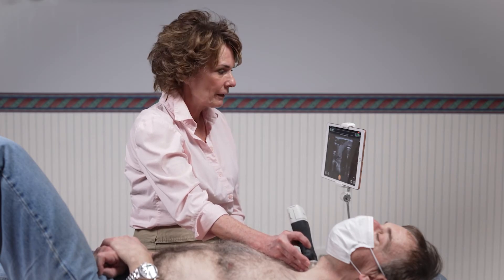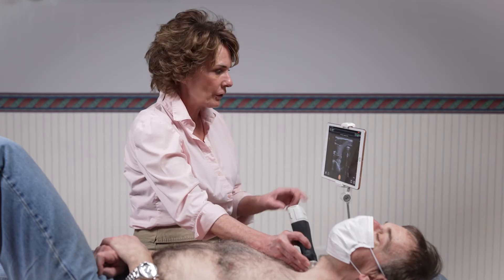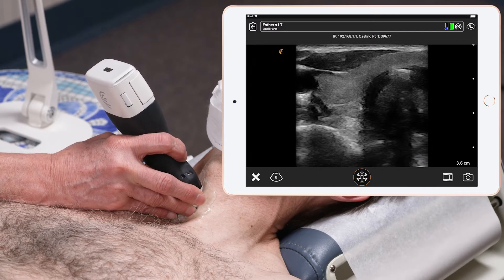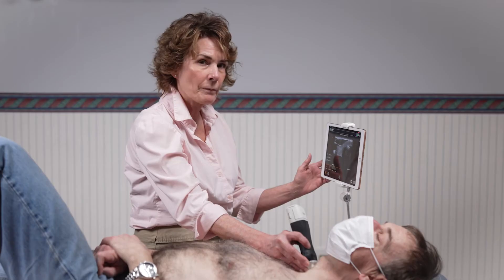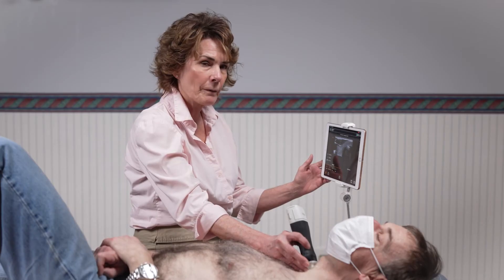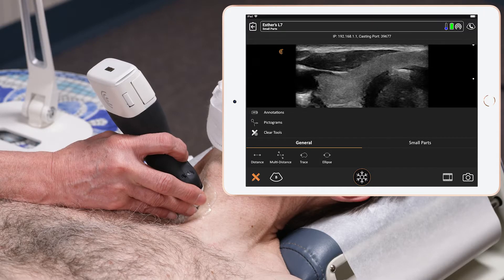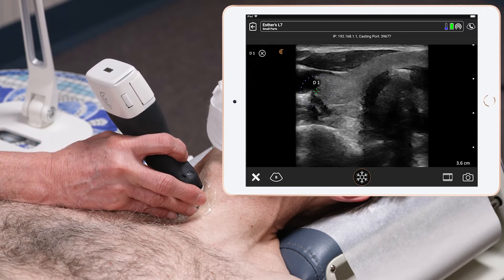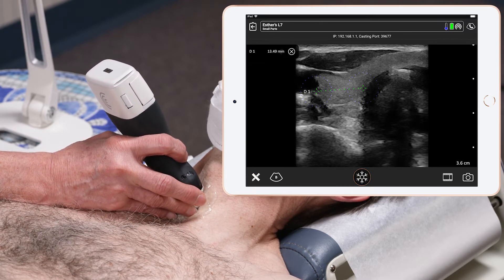I start on the right side of the thyroid, go to the mid portion, and I take a measurement of the width of the thyroid. I press the measurement tools in the bottom left-hand corner of the screen, select distance, and do the width of the gland.